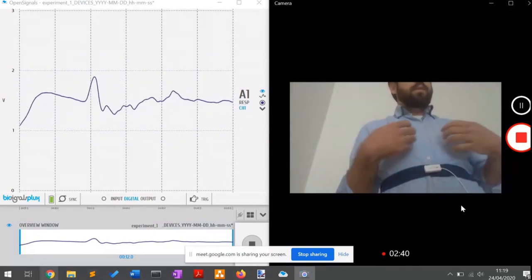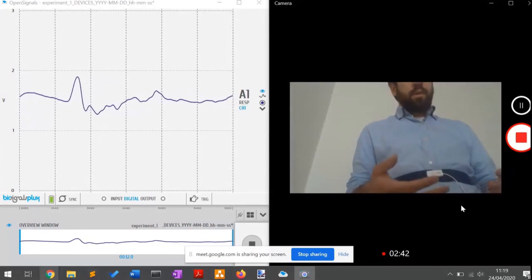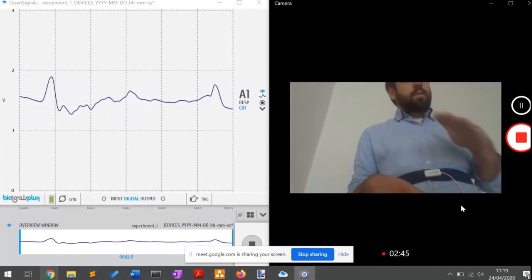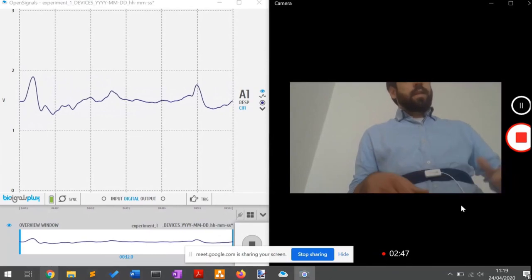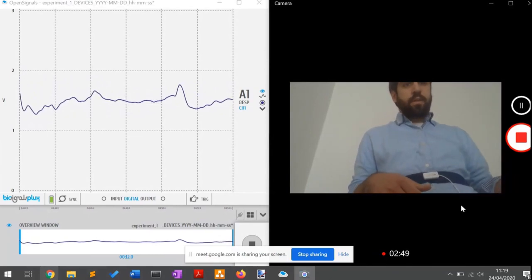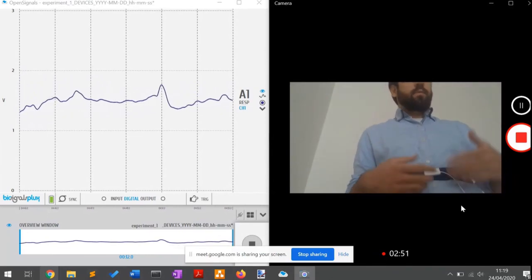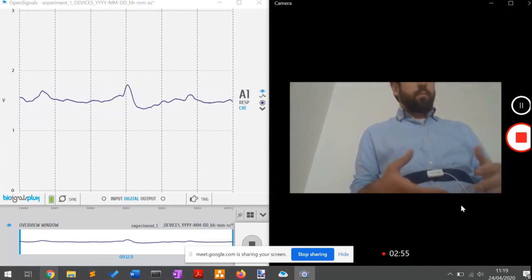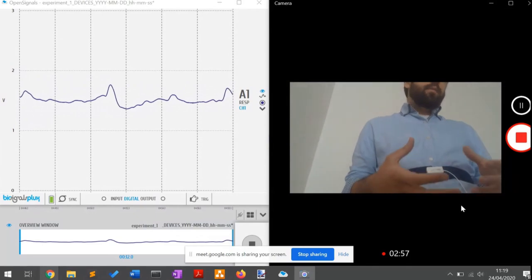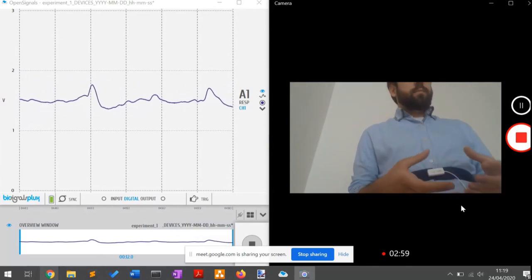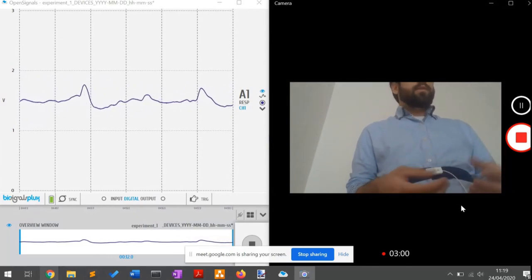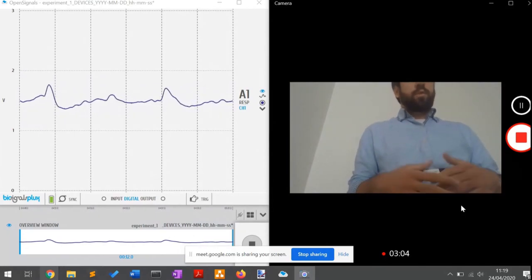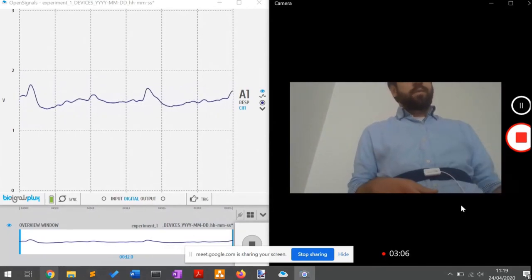If I hold my breath after expiration, one might think that the signal will stay at the valley until I take on the respiration again. In this case, it is not like this. The signal returns to the baseline when I stop breathing. This is important to understand because the sensor measures displacement — if we don't have displacement because we're not changing anything at all, it returns to the baseline.